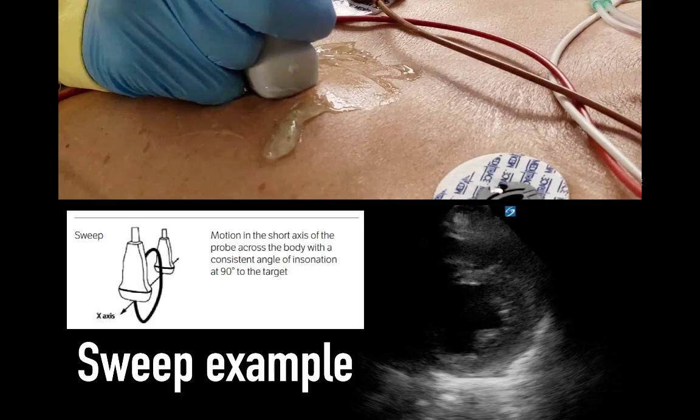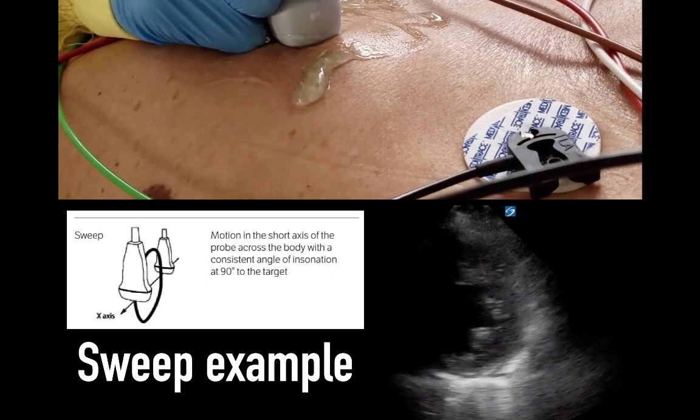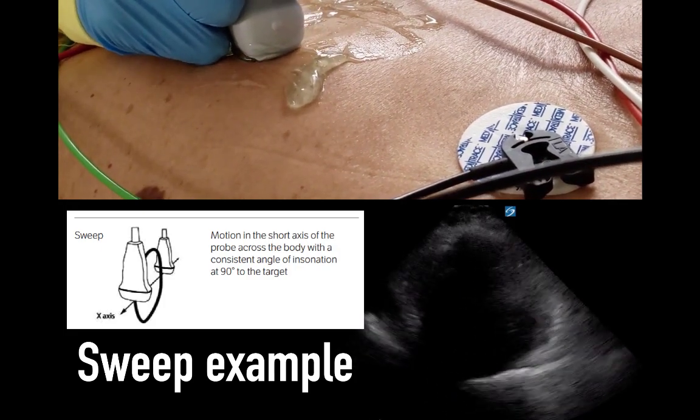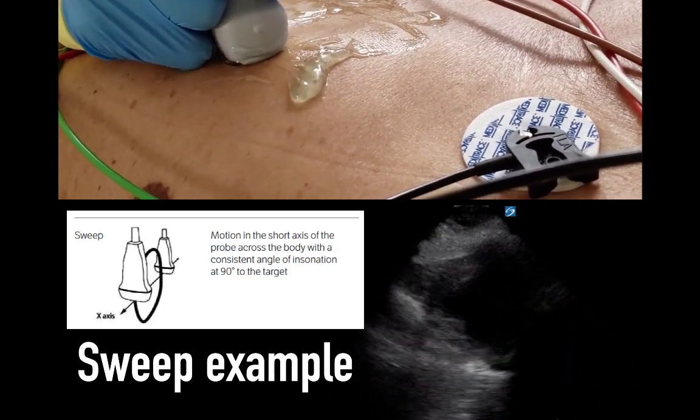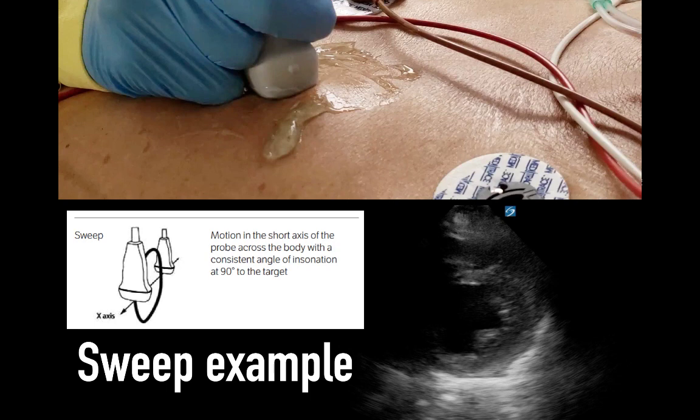Here is an example where we've acquired a parasternal short axis. In this case, the examiner will move medial to lateral, and you will see a transition from the base of the heart, near the mitral valve, to the apex as it sweeps laterally.